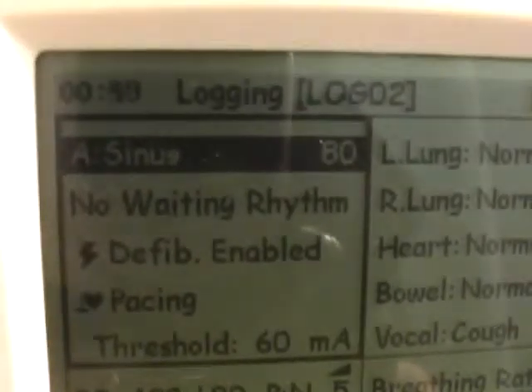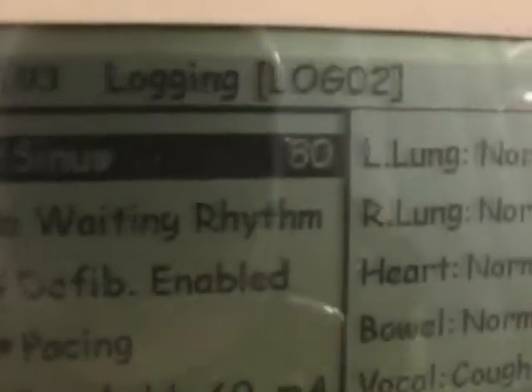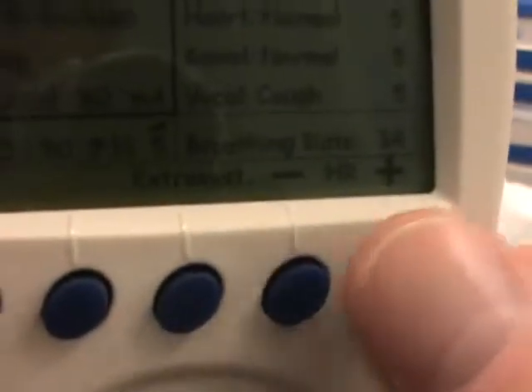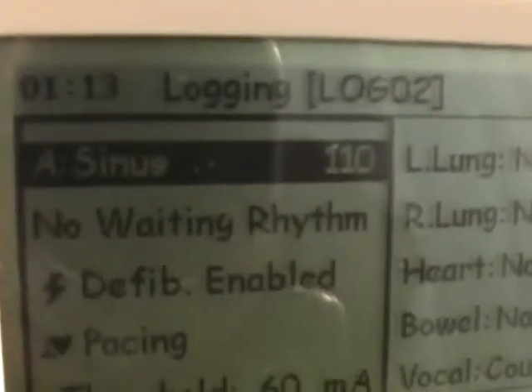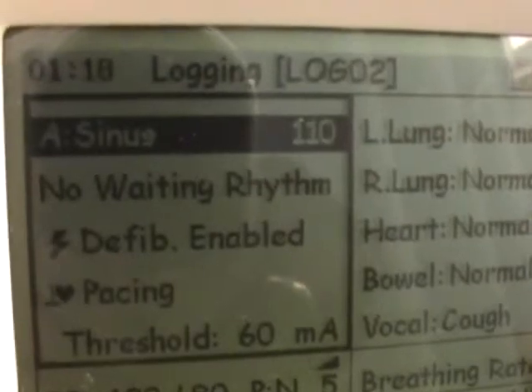Let's say we want to speed that up. I've got it highlighted already. To change highlights, you just scroll up or down using these keys, or to the side. Scroll up — I'm on sinus. I want to increase the rate, so I go to the arrows down here — plus or minus. Press plus, and let's put it at 110. And that's all there is to it. Now the heart rate is going at 110.